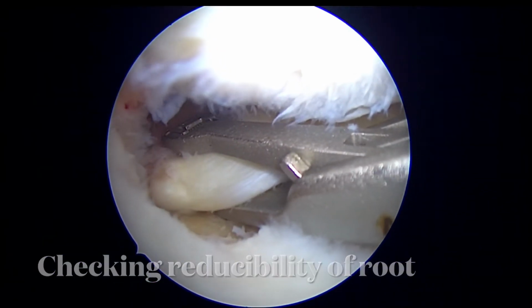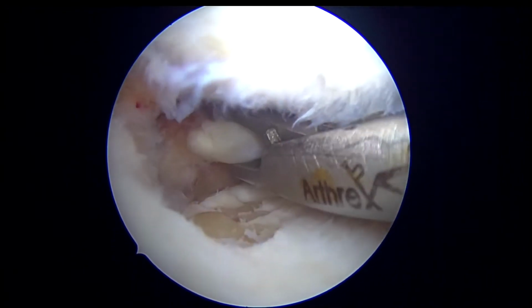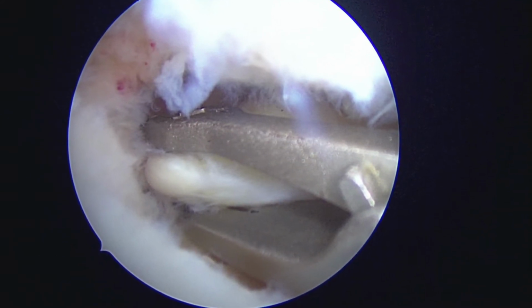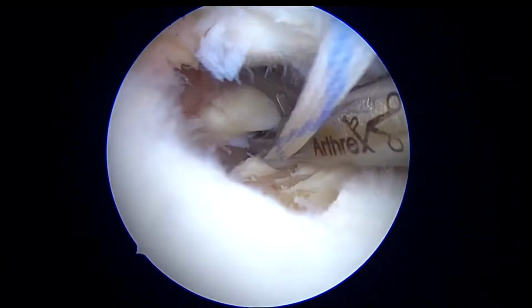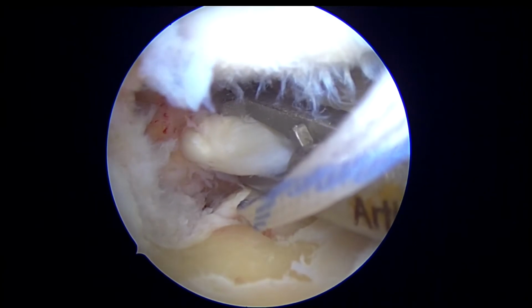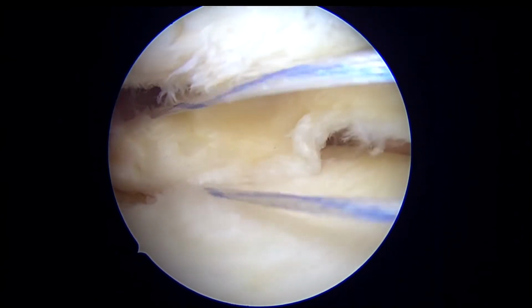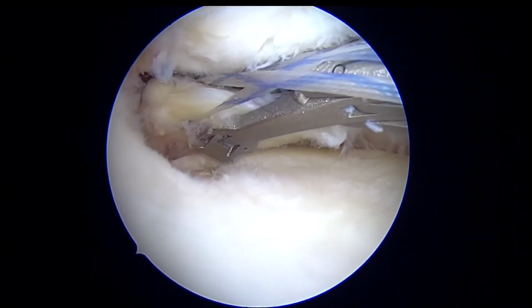So we take the knee scorpion and try and take hold of the root to see its reducibility to the anatomical position, and then we start taking bites with the suture tape. We'll be doing a single tunnel double stitch root repair.